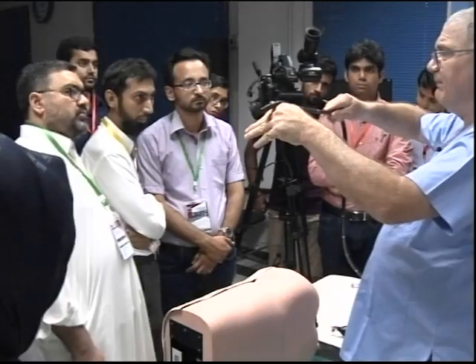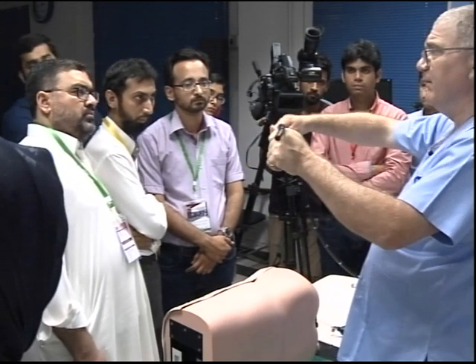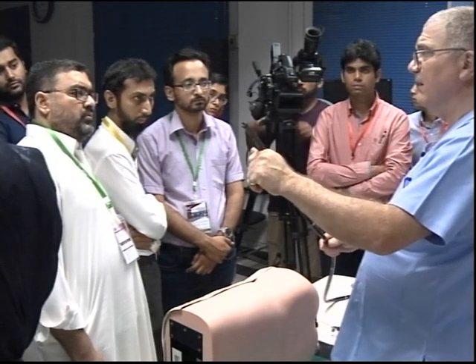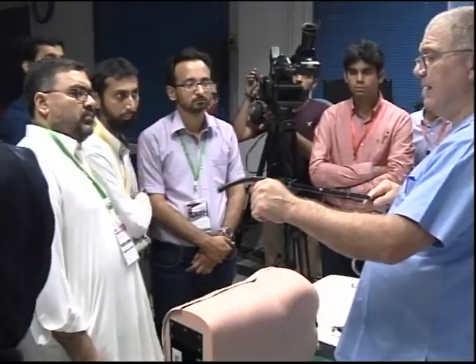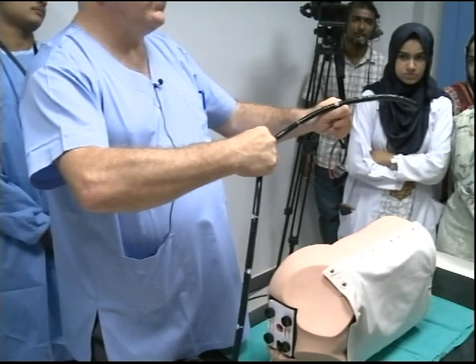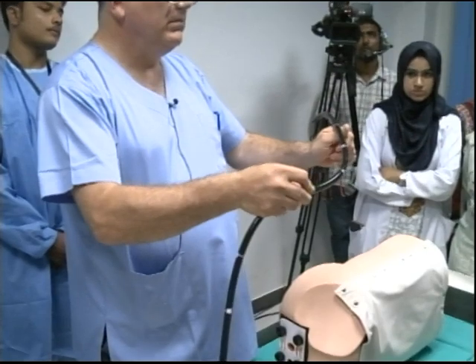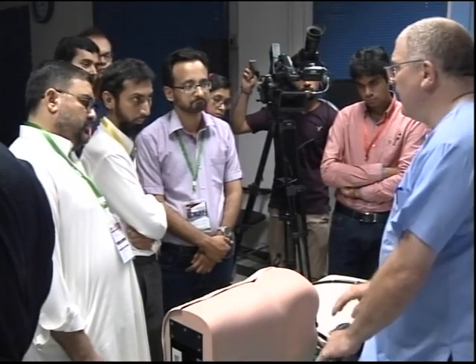We've got the scope. Watch the tip. I let my hand drift forward. I let my hand drift back. I let my hand drift down. I let my hand drift up. Keep it level, keep it in the direction. Keeps the scope going in the direction you want. If I have to do this, this is where it happens to the scope. If I let my hand come forward, if I let my hand go, yeah. Does that help?